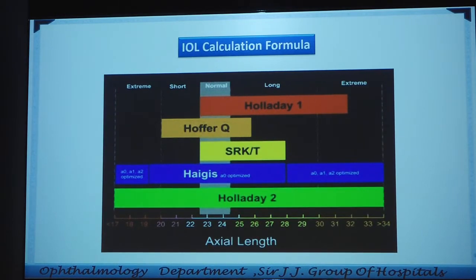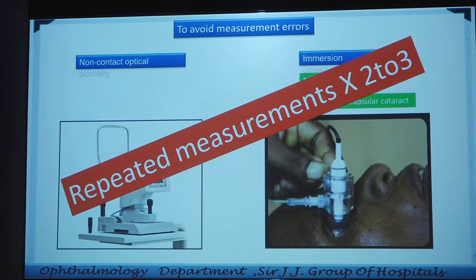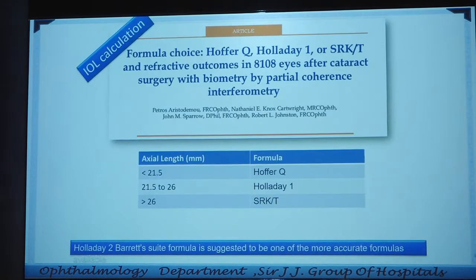And if you are doing SICS, okay, they push any IOL. In SICS it is any IOL. When there is phaco, you can say a course of 10 people; SICS course, 200 people. Still their mentality is, just do it, no formula. So please apply the formula, though it is SICS. It's a cataract surgery, and then you will be more happy.